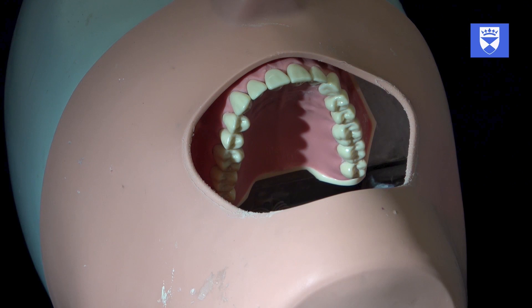Here we can see that the upper right central incisor has been traumatized. The end result of this traumatic dental injury has been that the tooth has become loosened.